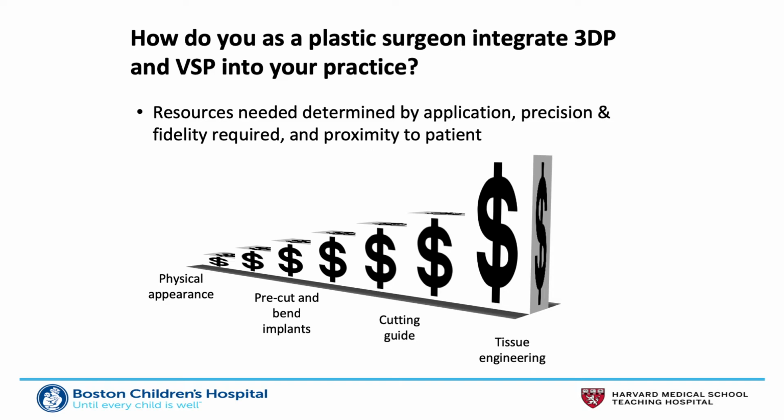And if you're really going to get fancy and dive into the tissue engineering realm, that's where it really starts to get expensive. And I think the idea for you guys as plastic surgeons is that you can start pretty small and at low cost. I mean, some of these printers cost in the hundreds of dollars. And then you can start to work up from there to explore ideas and change how you practice.